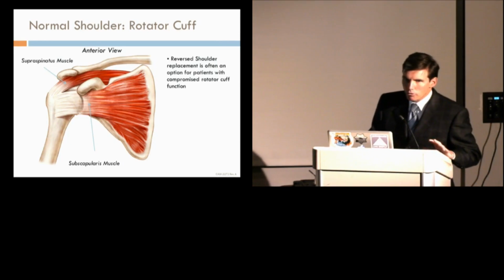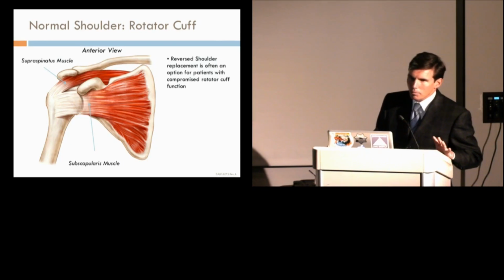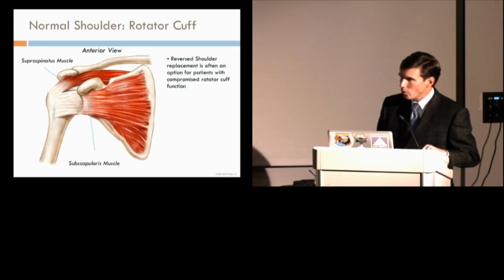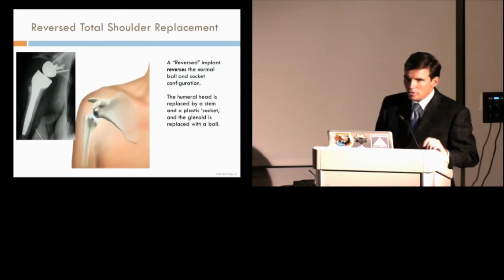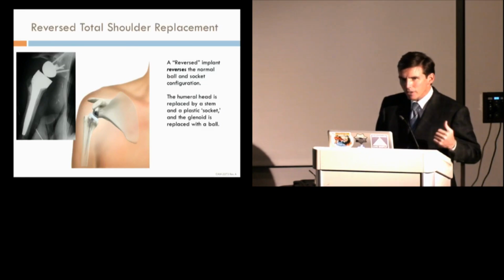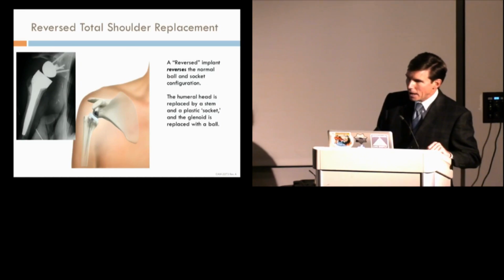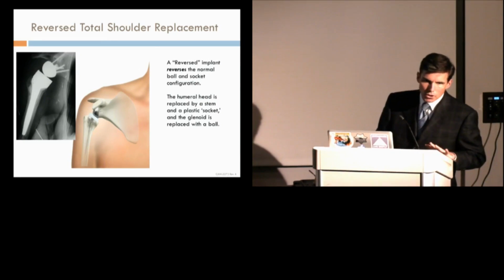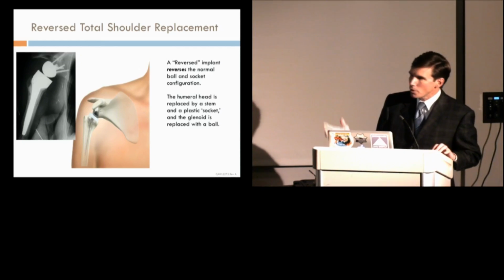Now, there are many people who have rotator cuff problems, and in fact, advanced rotator cuff disease can create shoulder arthritis. For patients who have arthritis of the shoulder and also have a massive or large rotator cuff tendon tear, there is a device that we use now, a shoulder implant called a reversed shoulder replacement. And this is specifically used for patients who have a bad rotator cuff and bad osteoarthritis. And the real good news about this is that this implant actually wasn't available until about 7 years ago, and it really has transformed our treatment of patients with these kinds of problems.